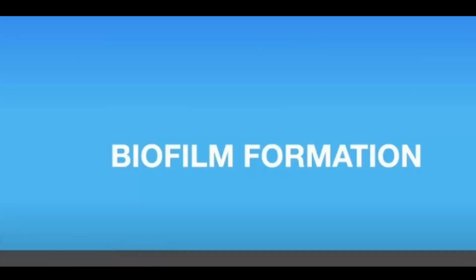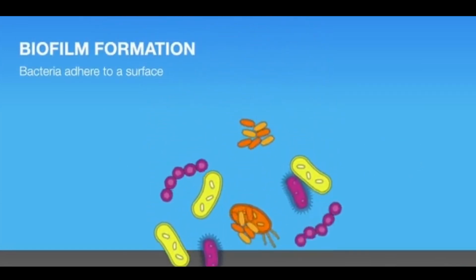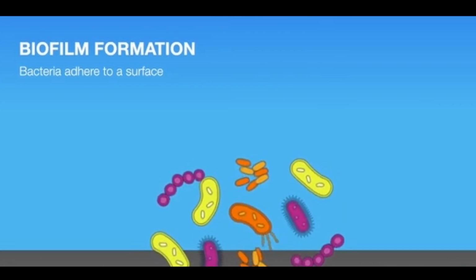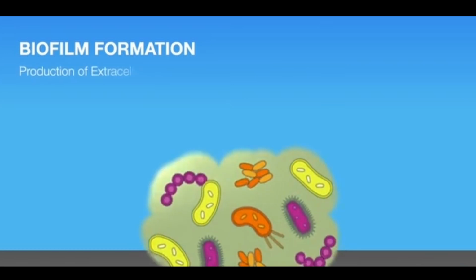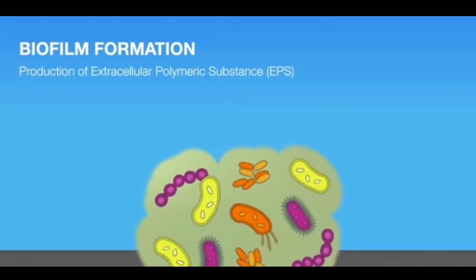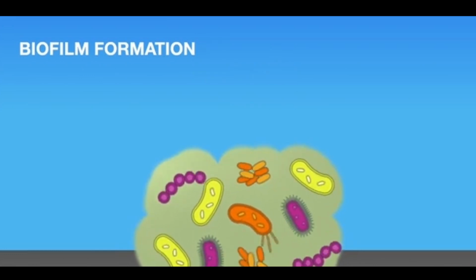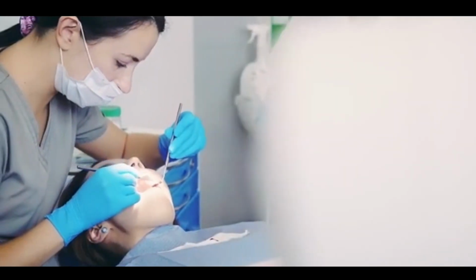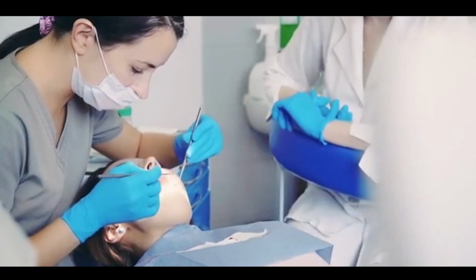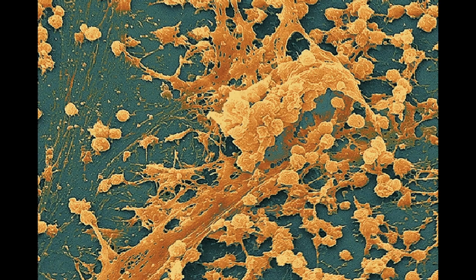What is biofilm? Biofilm is a thin, slimy film of bacteria that sticks to moist surfaces, such as those inside the dental unit water lines. Biofilm occurs in a dental unit water line because of the long, small diameter tubing, low flow rates used in dentistry, and the frequent periods of stagnation. As a result, high numbers of common water bacteria can be found in untreated dental unit water systems. A few disease-causing microorganisms found in the untreated dental unit water include Legionella and non-tuberculosis mycobacterium.